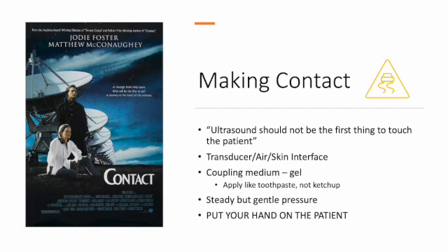And the way we do that is by applying a coupling medium or ultrasound gel. Now, every now and then we use other liquids too. I've seen someone use water. I've seen people use Surgilube. I've seen people use Hibiclens, all kinds of stuff. But the best medium, if you have access to it, is ultrasound gel.